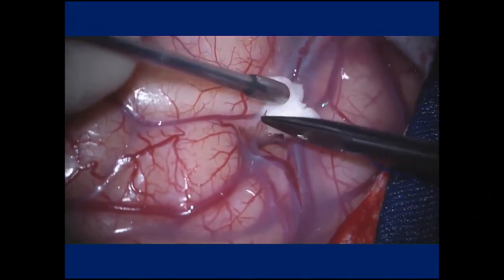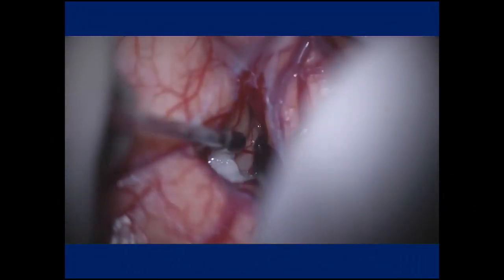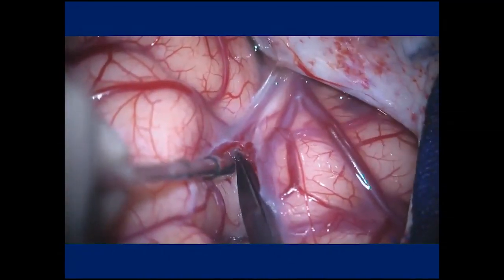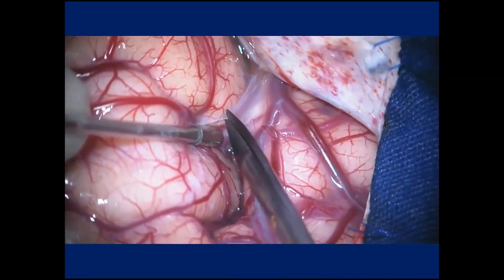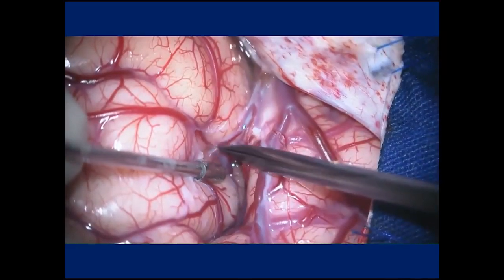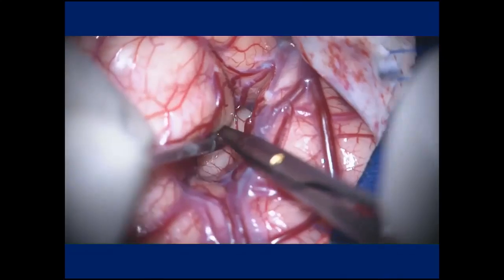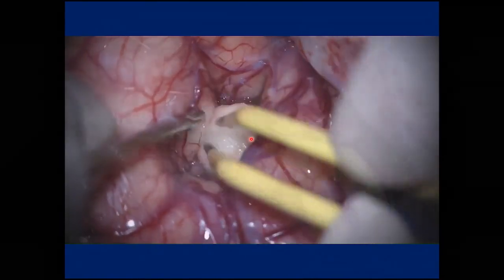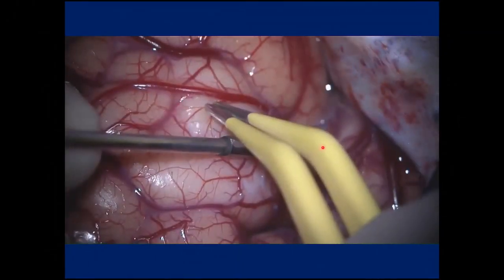In children, in general, the arachnoid membrane is thicker than in adults. So gentle movement, not to damage any vein. Very good microsurgical training, and dissecting. I'm trying to expose a little bit of the horizontal ramus of the sylvian fissure, the anterior limit of our resection. Here is the insula. And I'm placing a cottonoid to occupy the already opened space. So we'll keep it open.